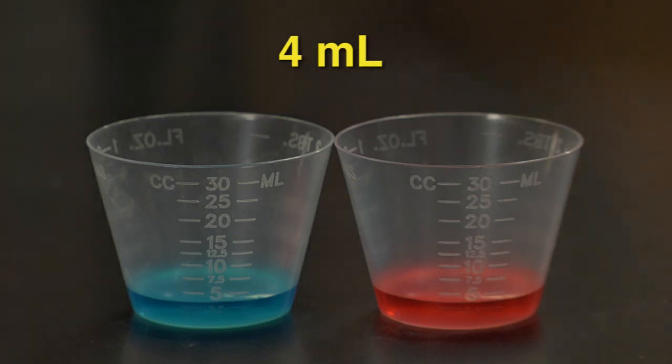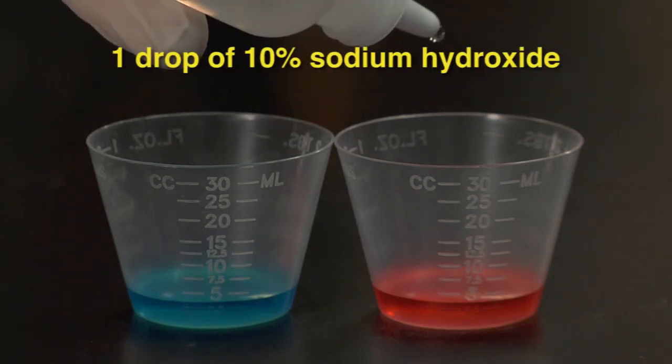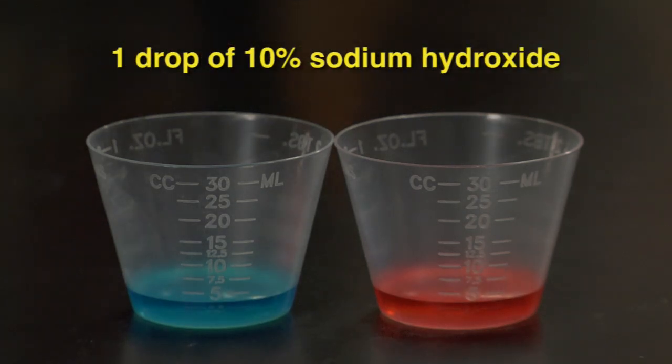Then we'll add about four milliliters of each substance to their assigned beakers. Next, we add one drop of 10% sodium hydroxide to each beaker and swirl each beaker to mix it up.